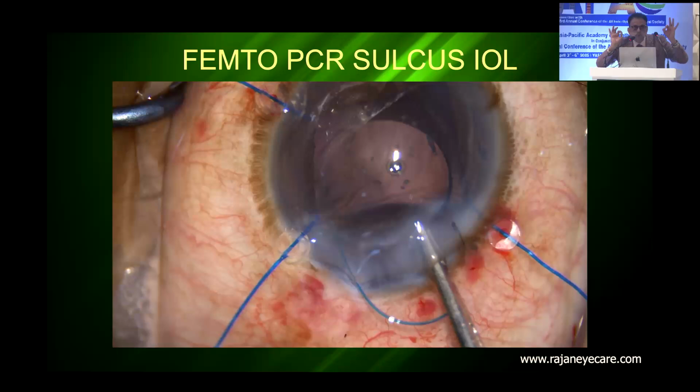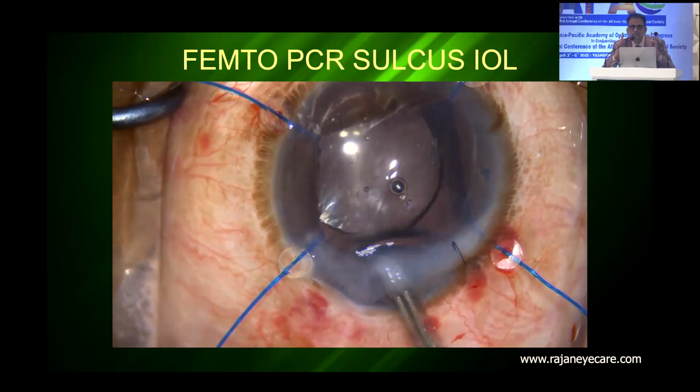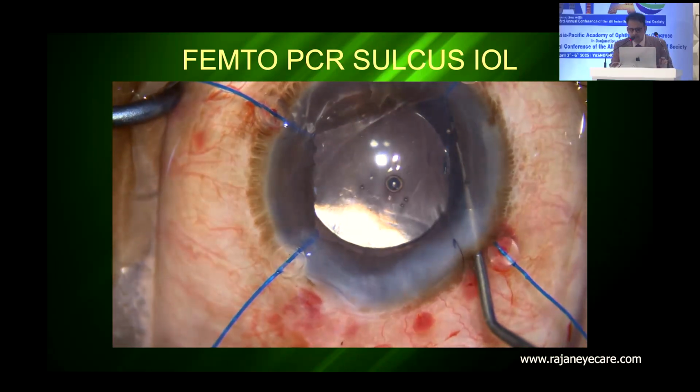So just put iris hooks. Take that extra time. Put iris hooks. Then see the sulcus properly. See the periphery properly before you put a lens. That's again very, very important for you.